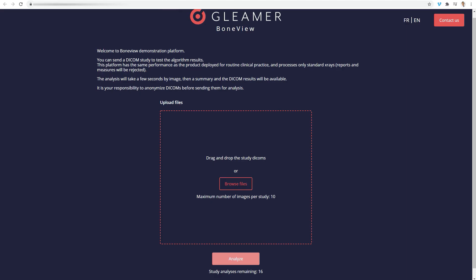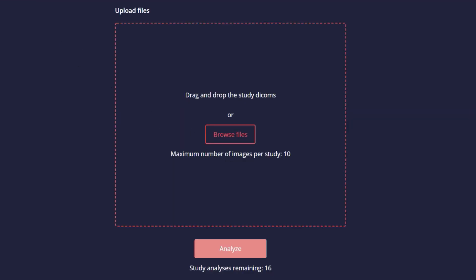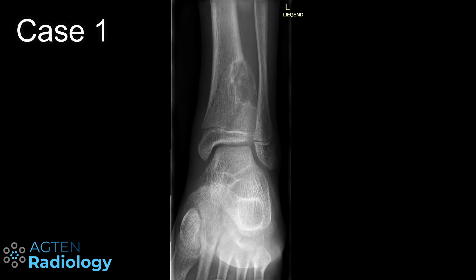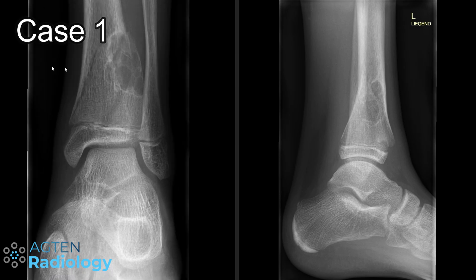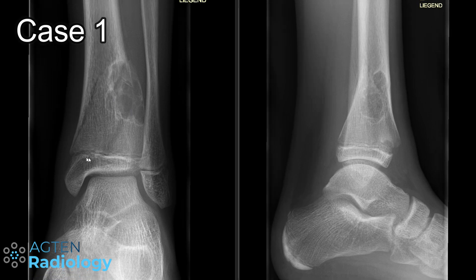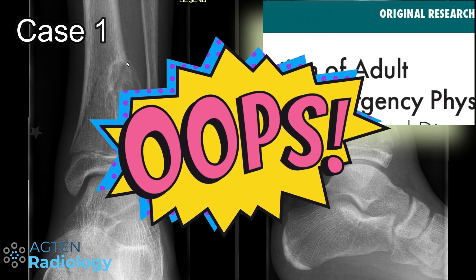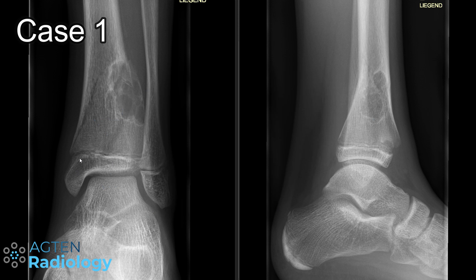Now we want to challenge the algorithm and see how it deals with difficult or not-so-obvious cases using the Gleamer demo portal. We've uploaded a few cases collected over the last couple of days. The first case is a non-ossifying fibroma of the distal tibia in a young patient. The algorithm is trained on patients from 18 years up, so this may not be entirely fair, but we'll give it a go. There is a pathologic fracture at the level of the non-ossifying fibroma, with some periosteal reaction.